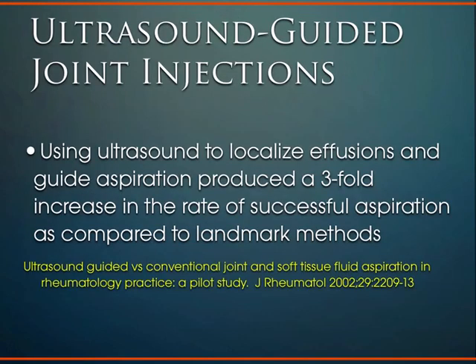I mentioned earlier, in terms of the application of ultrasound in the office, one is using it for image guidance for joint injections. And we've been doing joint injections for a long time using surface anatomy and your knowledge of it to guide your injection and identify the joint space, the tendon sheath, and your soft tissue structures.